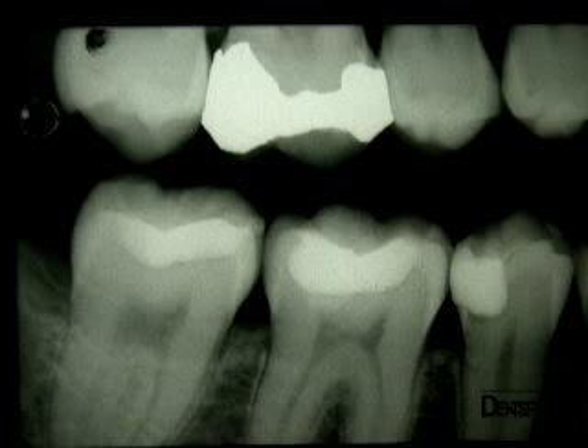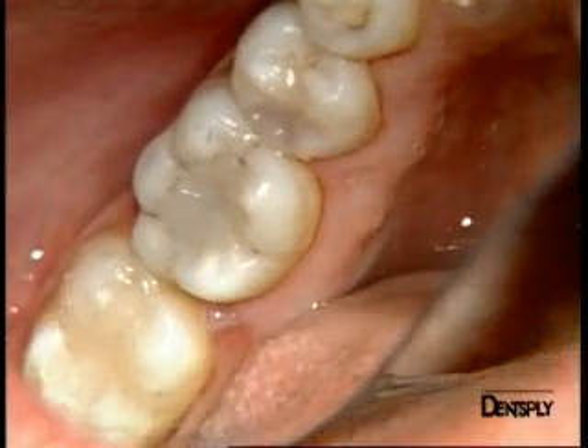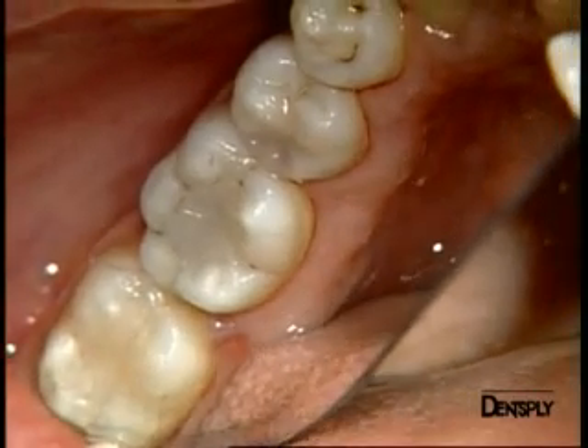We have shown how valuable this new generation of composite Quicksville is. The material is easy to use, does not stick to instruments, and allows fast bulk placement. We can now, in one session, treat multiple teeth with large cavities.